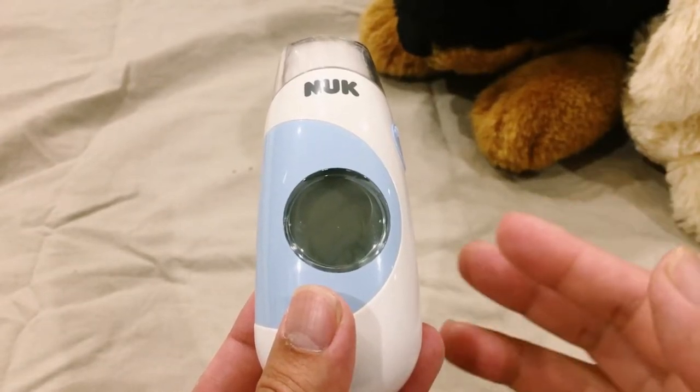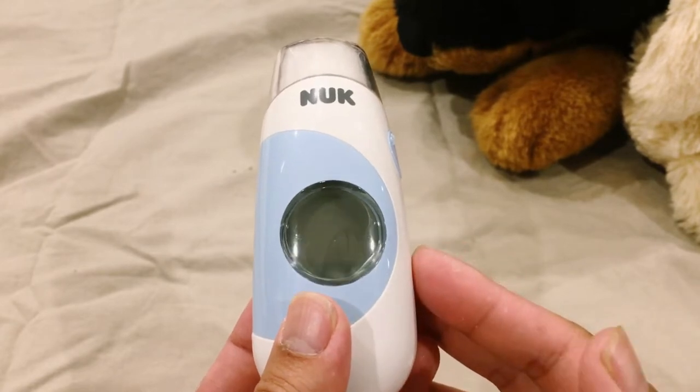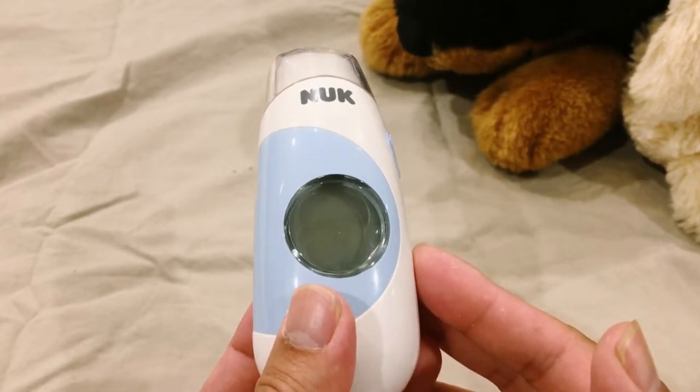Today we're going to show you the NUK Flash Forehead Thermometer. It can measure body temperature, surface temperature, and room temperature.